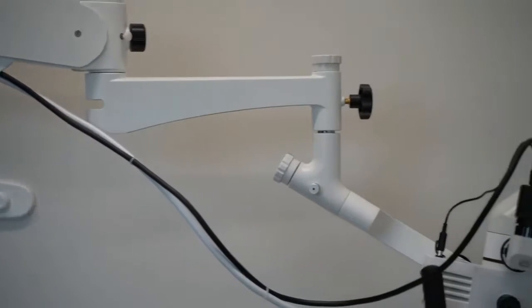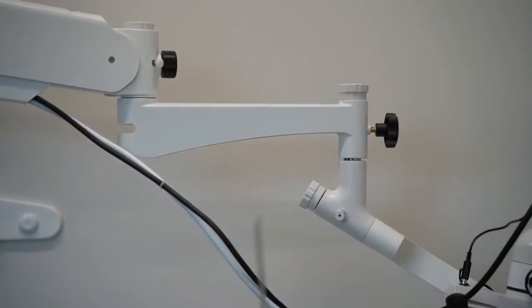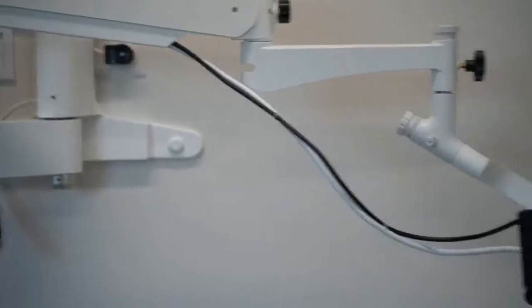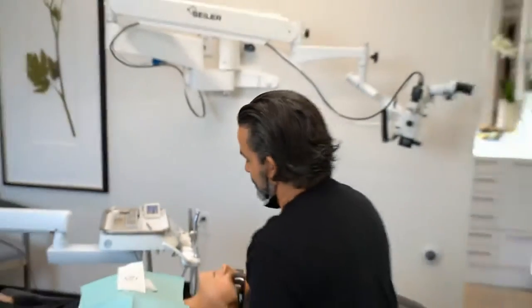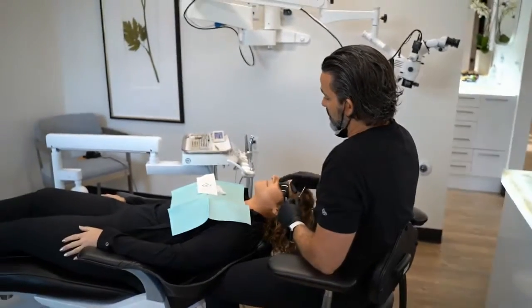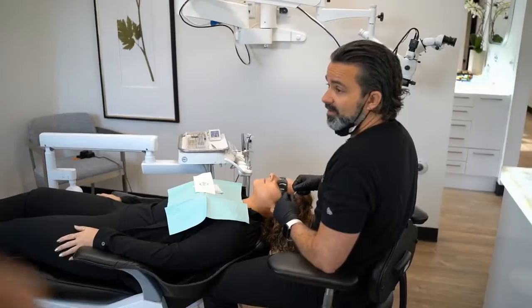There's also different lengths of this arm, and this is kind of extreme because even though I always preach working in 12 o'clock, when I'm doing an apical surgery, I'm bending the chair. Let's say I'm working on the lower left quadrant, and this is the only time I break from 12 o'clock as an endodontist, especially on a lower mandibular apico.